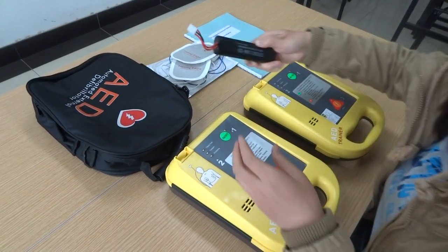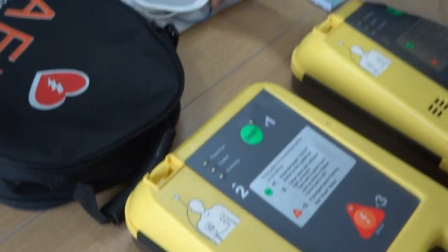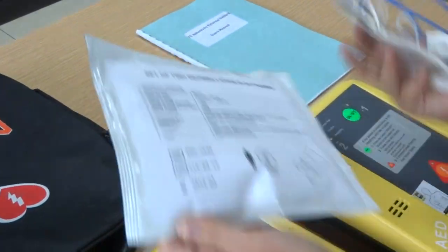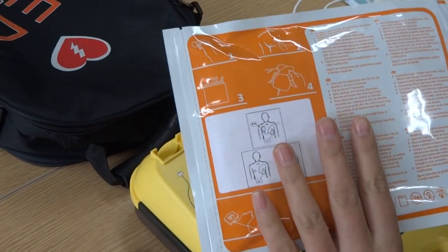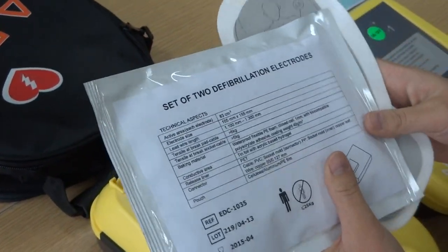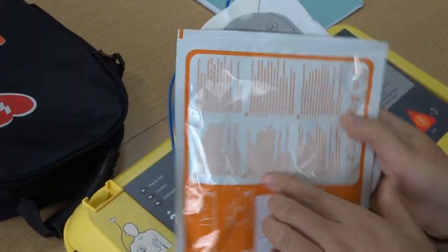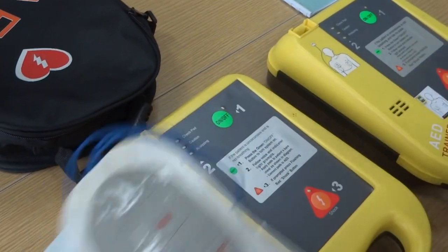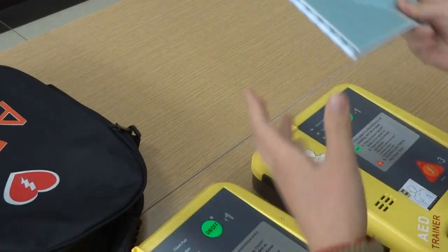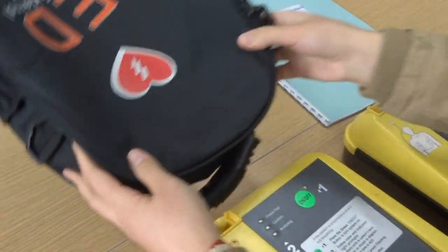This is a battery. Electrode pad — this pad has been opened from the package. Later we will use it to operate. Also included is a user manual and one bag.